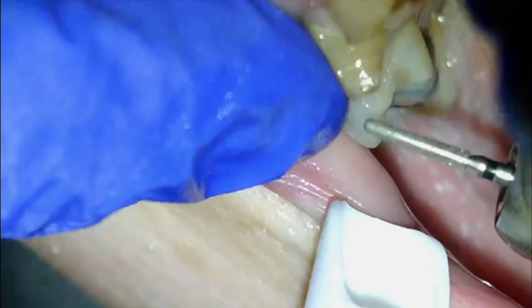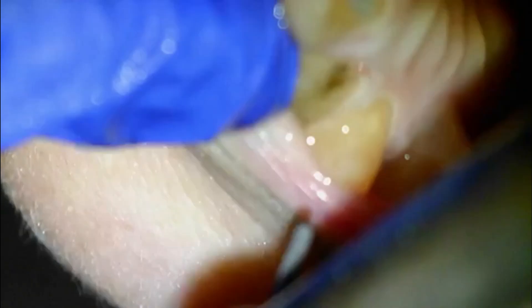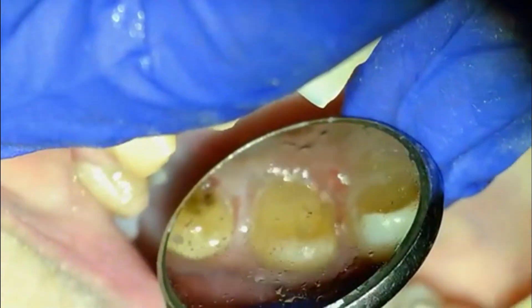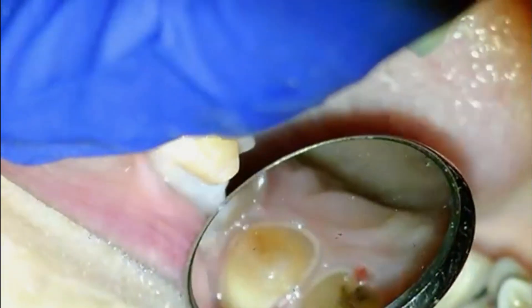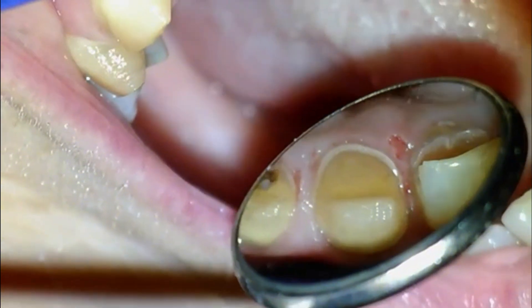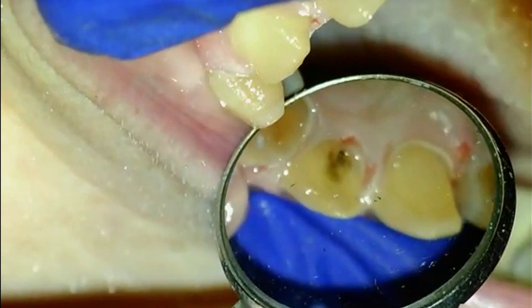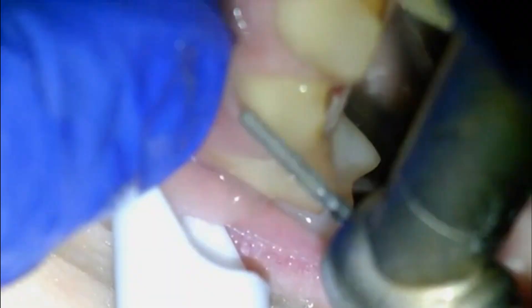Excuse the blurriness — just moving a little bit puts it back into focus. That's how short the focal range is; this is a 5x zoom on this camera. Here I'm removing a little bit more, making sure that the divot on that lateral incisor is looking good. Don't be afraid to hit the gum tissue — the gum tissue is going to be fine, it's going to grow back. What you don't want to do is remove the papilla. If you do have to remove some papilla because hyperplasia occurs, you want to make sure you still leave the shape of that papilla.